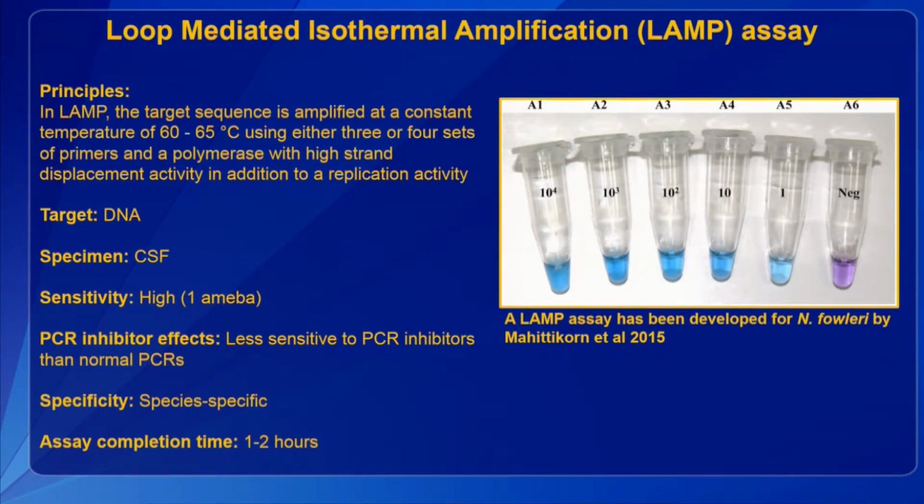The specimen would be CSF, but the one that was developed has never been used with clinical patient specimens. So we want to test it for clinical patients and see how it works. And it should be species-specific, and it would be rapid.